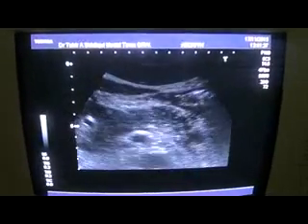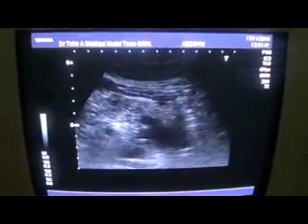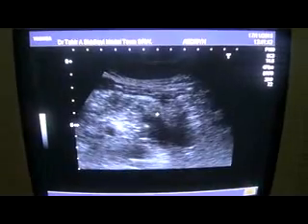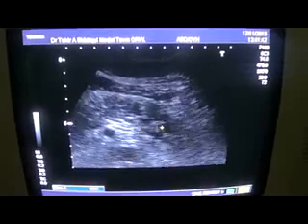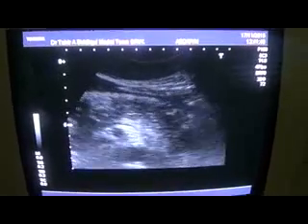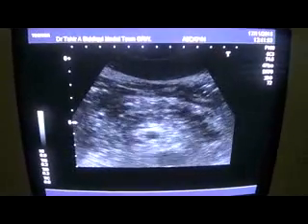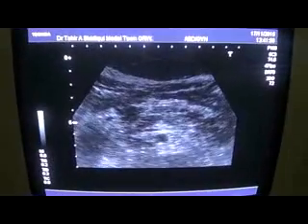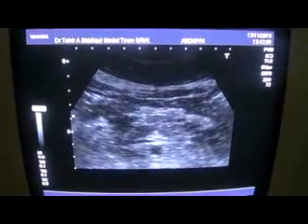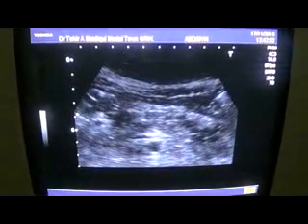So this is pancreatitis, and again you see fluid. This is the tail of the pancreas, and this is the fluid. So this is pancreatitis of obstructive nature, and the cause is the gallbladder. Most probably the gallbladder has led it to this form.